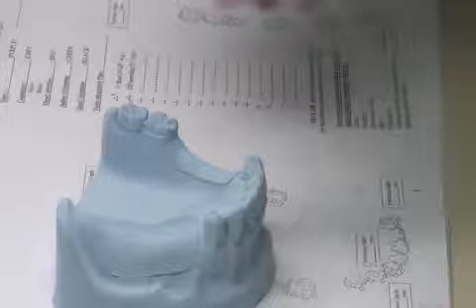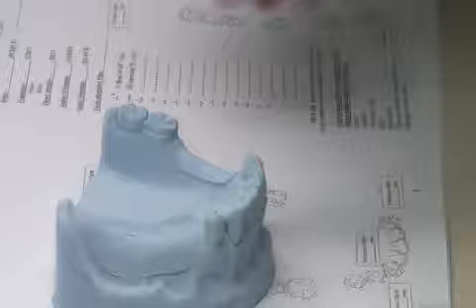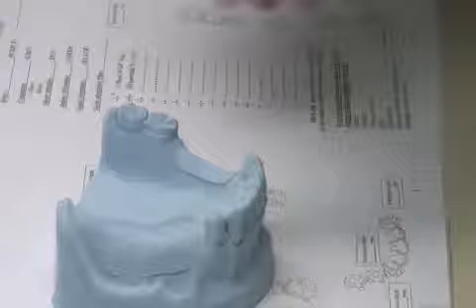Okay, now to the second part, which is actually putting in components and drawing the design as we have done earlier. The cases you got in our lab, the casts were designed to have a bounded saddle on one side and a free end saddle on the other side, for you to practice and know how to deal with these major types of support.